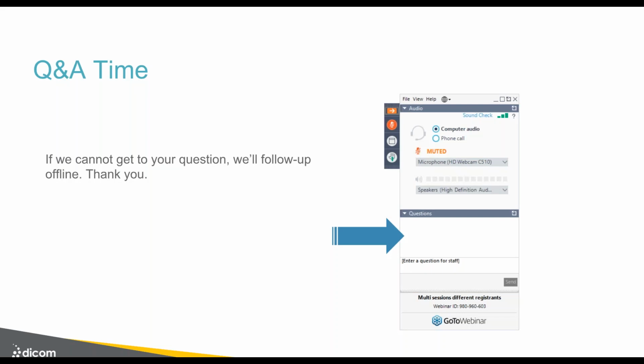And then we have a couple of other questions. Let me go through a couple of them here. What about third-party non-standard DICOM tags? That's a very interesting question. As you know, modality vendors and PACS vendors take a lot of liberty with the DICOM standard, and we routinely run into non-standard DICOM tags. If you were to apply a cookie-cutter process to de-identification of those images, you would probably miss those DICOM tags that could potentially contain PHI.